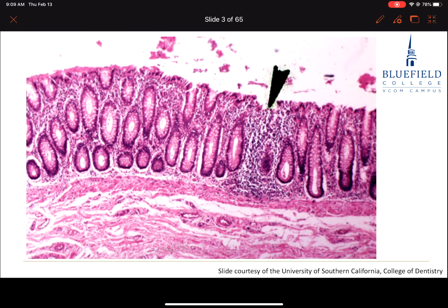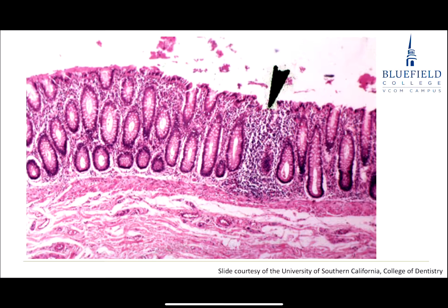And this is normally on the left side over here. This side over here is showing you the connective tissue. There are straight tubular glands, but the connective tissue between those tubular glands, that's about the number of nuclei you see. And then we've got a region right here where we've got more nuclei pushing down even into the smooth muscle layer a little bit, isn't it? Can you see where there's more nuclei in this region than over to the left or the right? Okay? See more nuclei, lymphatic tissue, no nodules, so diffuse lymphatic tissue. Okay, does that make sense?